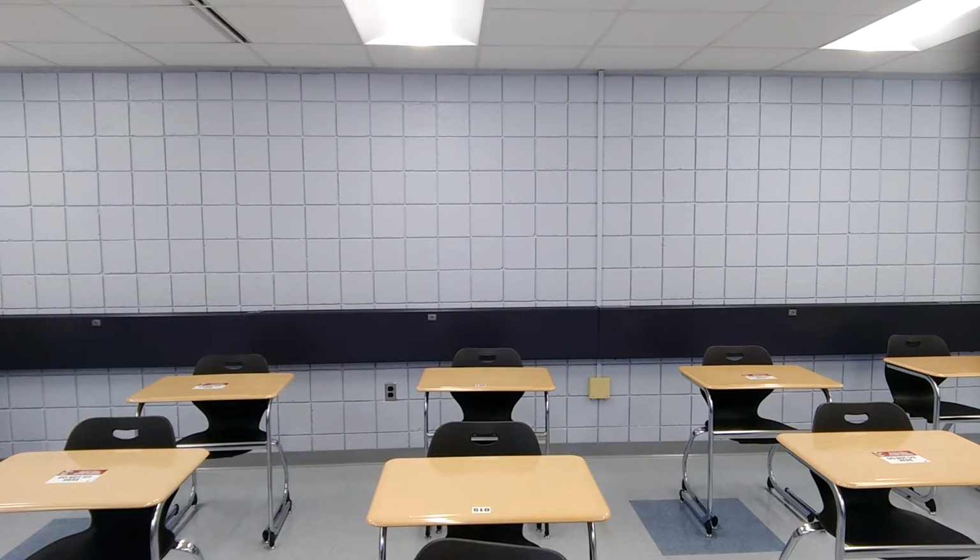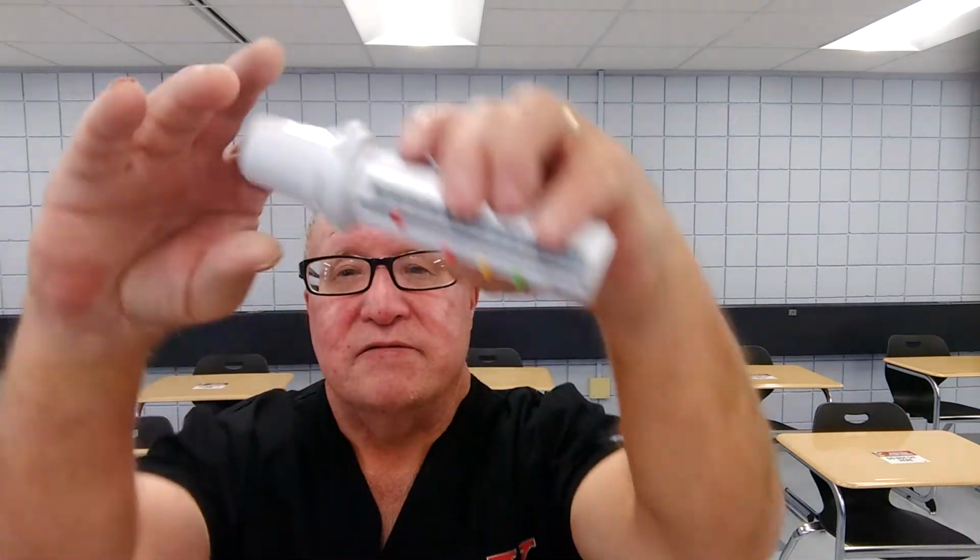Again, there are several different ones on the market, but they're still all done the same way. So I'm going to give you an idea of what each one of them looks like, and then we're going to proceed with showing you how to do the test. Now, the first thing we're going to go over is the peak expiratory flow meter. Again, this is one that you'll see.